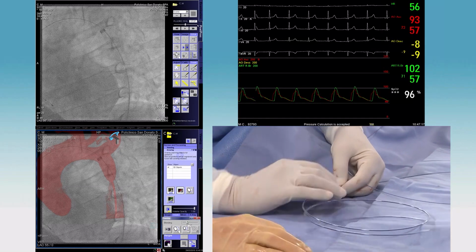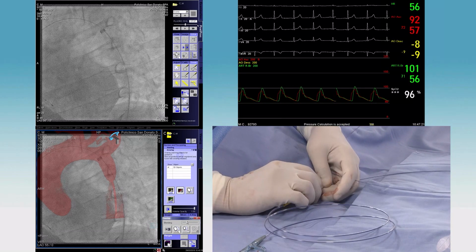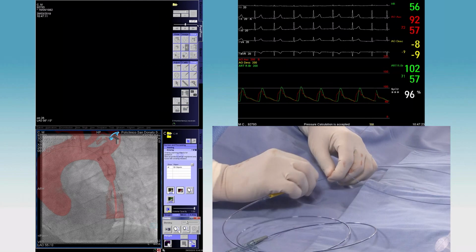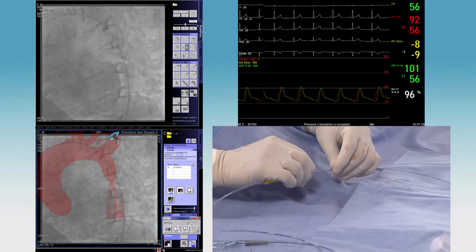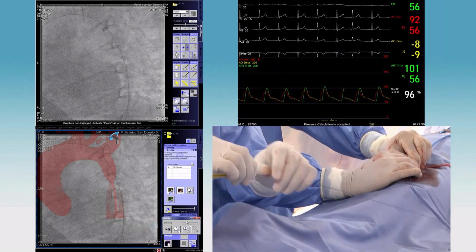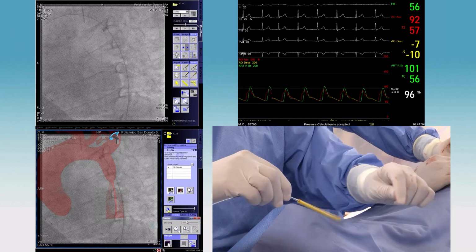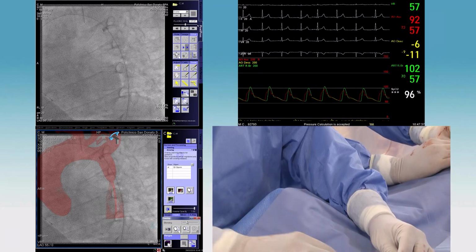This balloon's burst pressure is around 5 or 6 bars, I think. But this 18 one can be overdilated subsequently up to 30 millimeters. So there is that capability. Obviously, if you have to dilate to that diameter, then it will shorten quite a lot. So can I have a flush syringe?